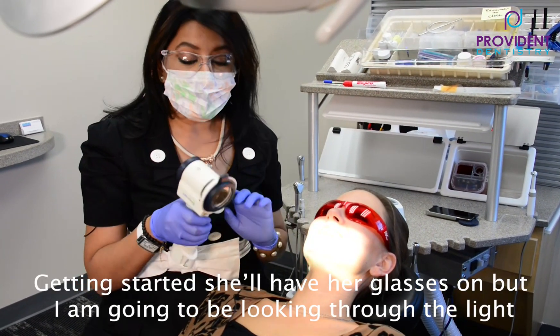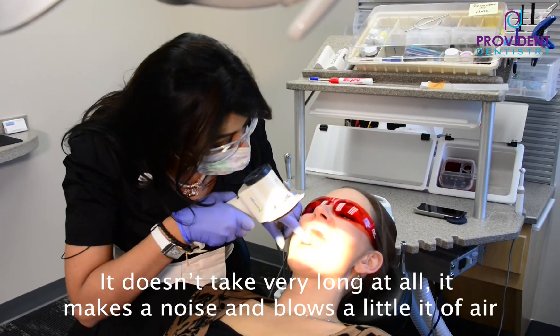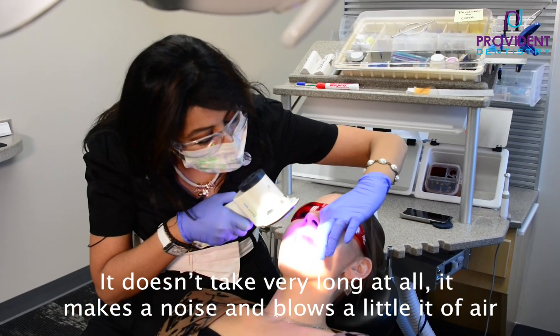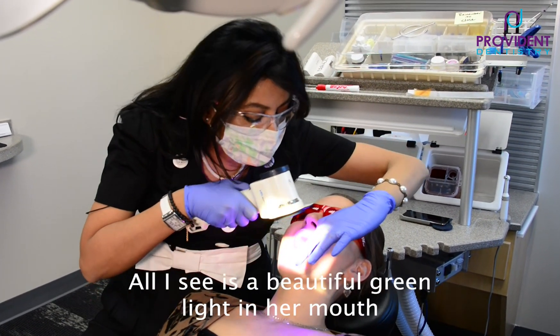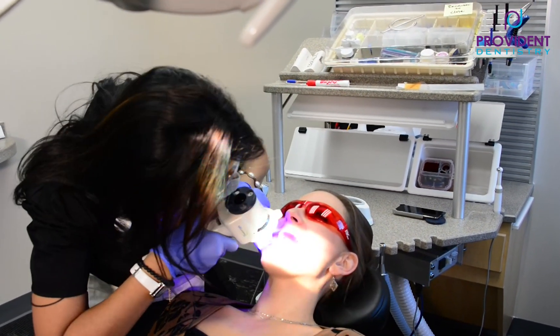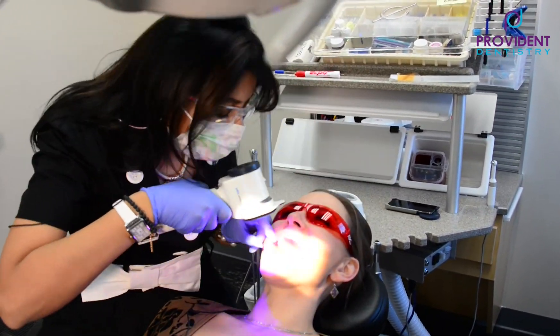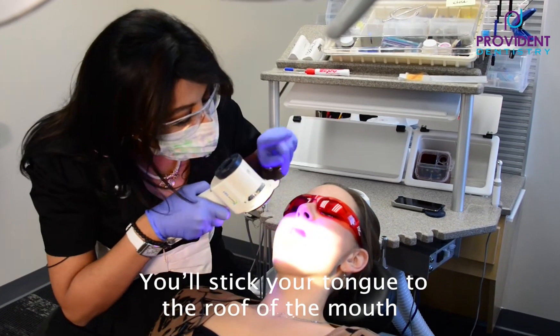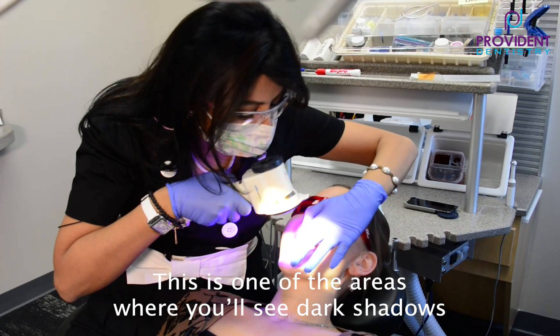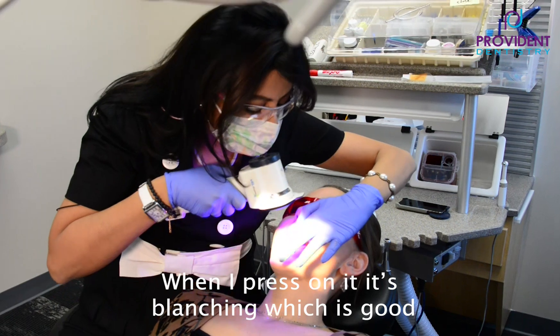Let's get started. You've got your glasses on. I don't need my glasses because I'm looking through the light. Open for me, please. It doesn't take too long — it just makes a noise and blows a little bit of air. All I see is beautiful green light in her mouth. Stick your tongue on the roof of your mouth, please. This is a common area where you will see some dark shadows, but when I press on it, it is blanching, which is really good.